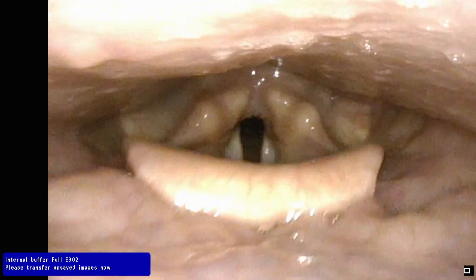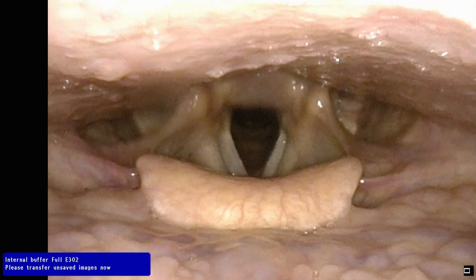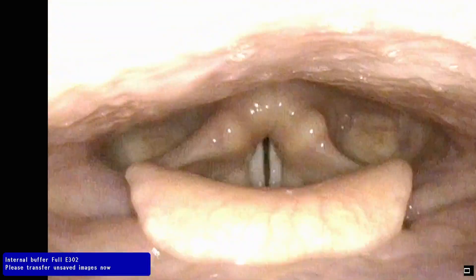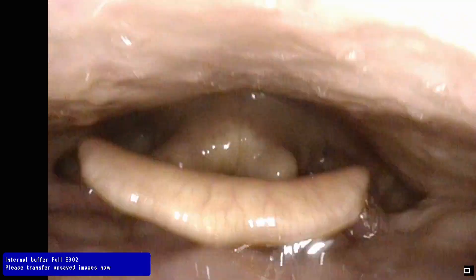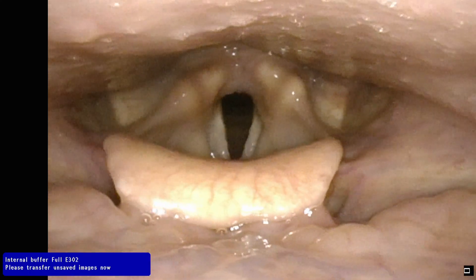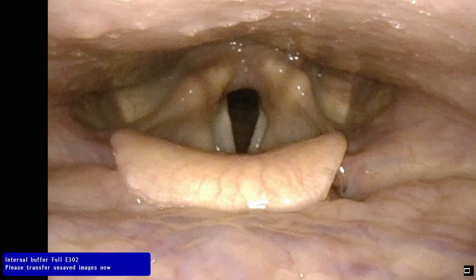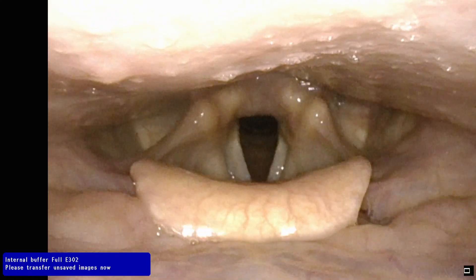Let's do that again. Try to keep a really conscious effort of keeping your tongue a little bit further forward in your mouth while you're singing — let's see if that helps at all. Do, re, mi, fa, so, la, si, da. Yeah, so see how there it kind of blocks it out. So I think if we continue doing those tongue stretches, I think that will be helpful for you. Now, I should say, some engagement of the tongue is normal because when you want that singer's formant, that singer's ring, you engage the tongue. Because it creates a rounder space and that's when we get that nice ringing tone.